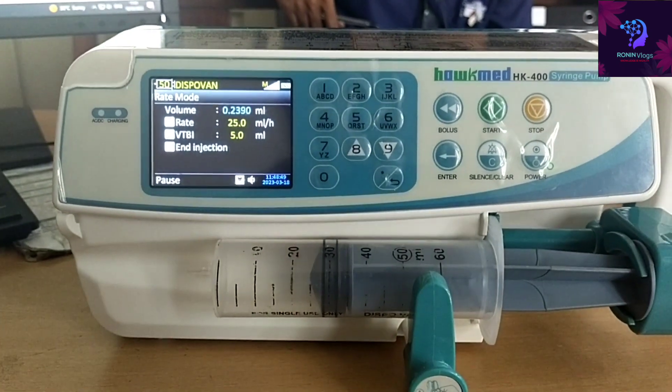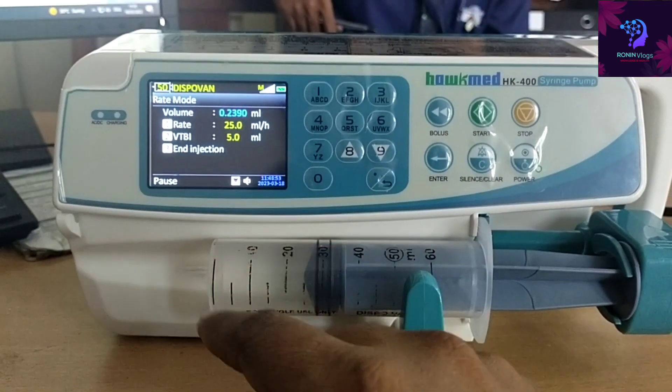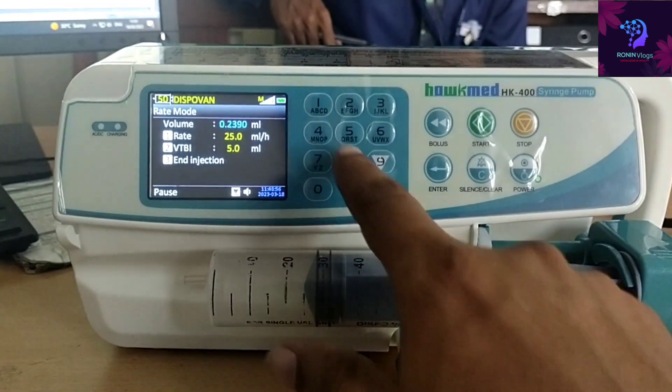Now stopped. All the details — volume and how much has gone to the patient — will be shown. To end the session, just press button 3 for end and then confirm end.